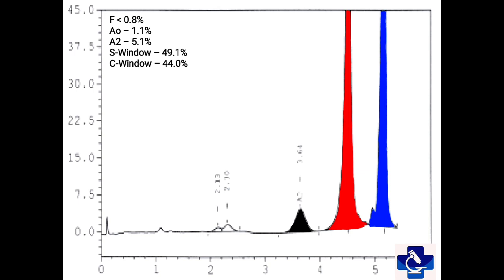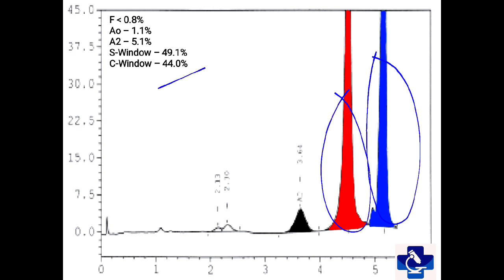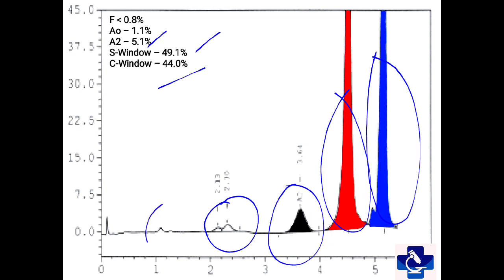In this HbC graph, we have the C window having 44% of hemoglobin and the S window having 49% of hemoglobin. A2 is raised at around 5.1%, A0 is 1.1%, and fetal hemoglobin is less than 0.8%. Obviously, this is a graph of sickle and hemoglobin C double heterozygous.